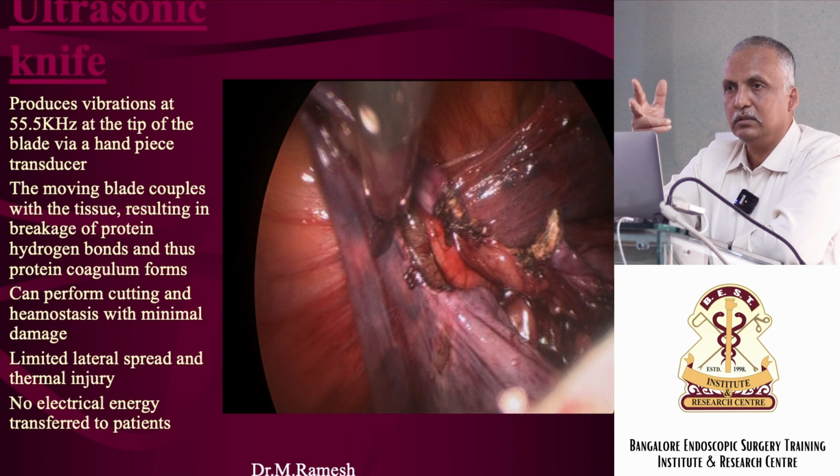See, when you are catching a duct, the duct can necrose and open up. A vessel, an artery or a vein, you are catching with a harmonic scalpel. After some time, there is nothing called delayed burns. The blood is clotted. The blood vessels will never open.